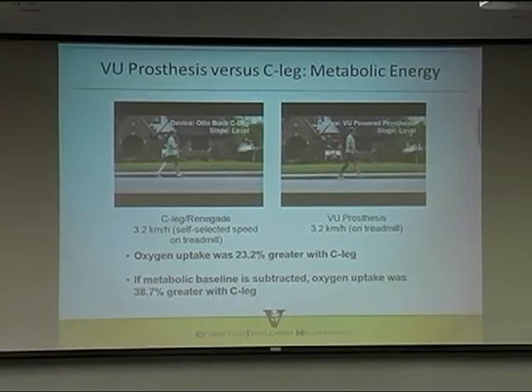One is we have better biomechanics. For instance, when he doesn't have that shock absorption with this leg, that's energy loss, so his efficiency is lower. The other reason is that this leg is actually contributing energy to him. It's got batteries on it, and the batteries are slowly being drained by the motors, which helps push him forward. So he's got something else there doing work for him.